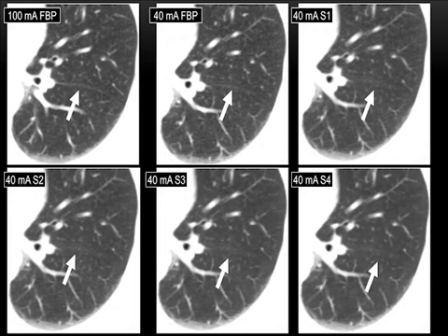So this is literally the disappearance of a major structure in the lungs, which is definitely not accepted by any of the thoracic radiologists. So it's very crucial to pick the right setting. Probably I can kind of hallucinate that there's a fissure over here based on prior knowledge. But the key message here is you're lowering noise, but be careful about the visibility of smaller structures.